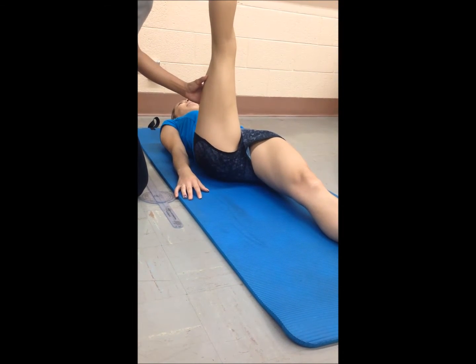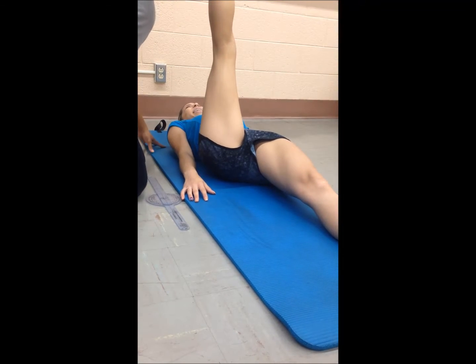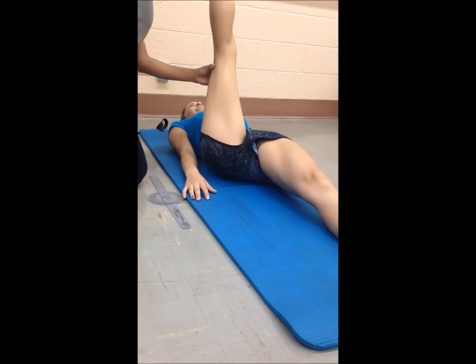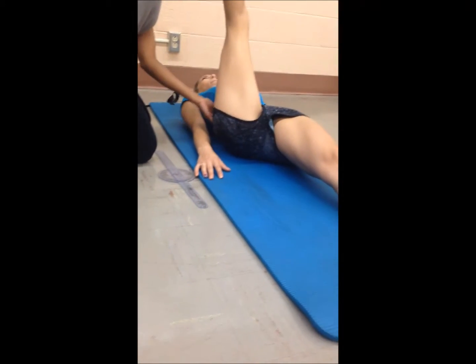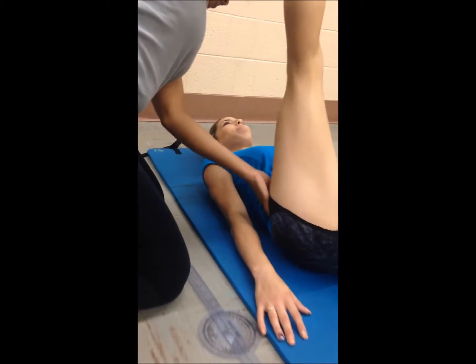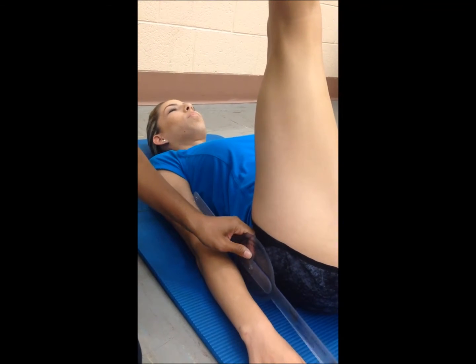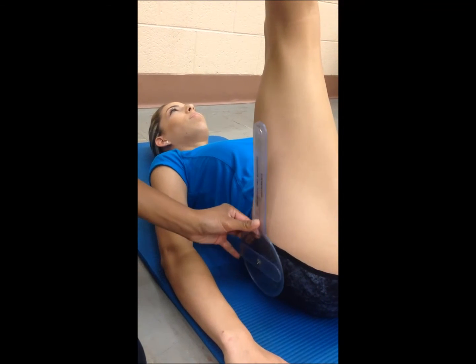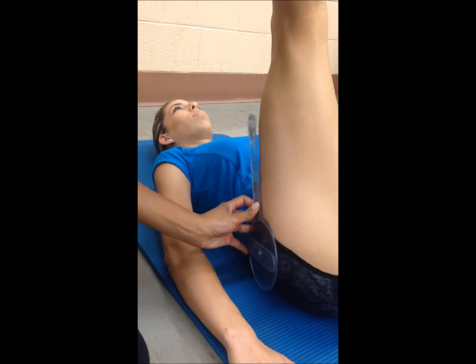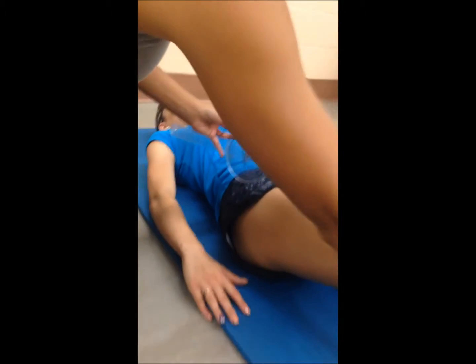You will use the goniometer by placing its axis on the greater trochanter. The desired angle the subject should have is 90 degrees. If it is at 80 degrees, it is acceptable, and past 90 degrees is also acceptable. Anything under 80 degrees is unacceptable. Once you obtain the measurement, you will record the angle and determine whether the range of motion is acceptable or unacceptable. Once this is done, you will repeat this procedure with the opposite leg.